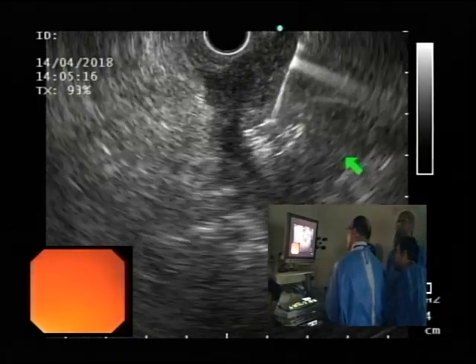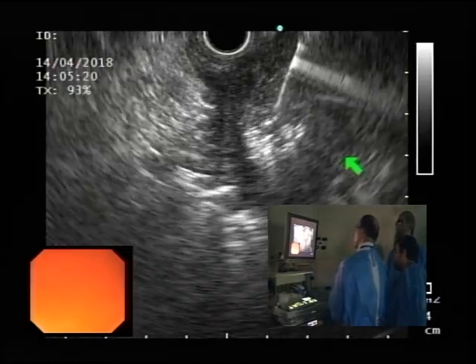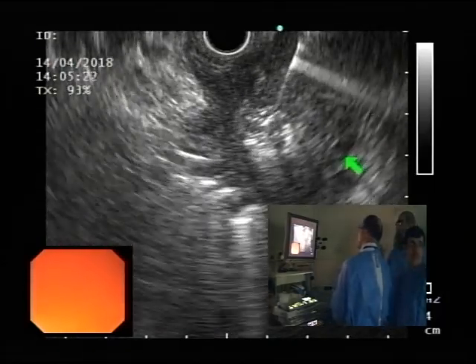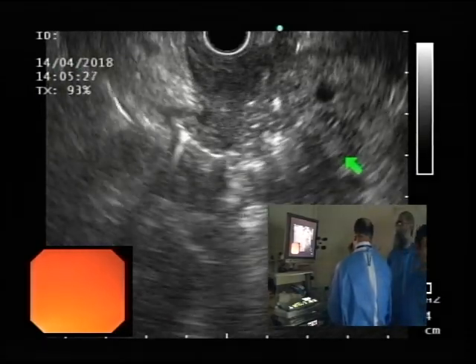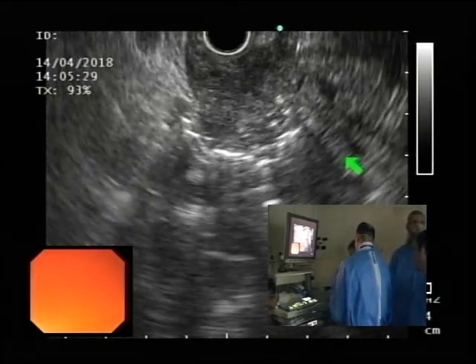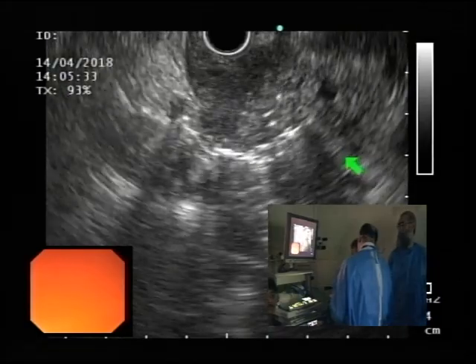Because we got enough cells. Okay, so let me do the third. So you just need to send some sample for the cell blocking. So I think you'll need an ERCP साथ है. ये लॉक करो. उनको बता देंगे. We'll try and do it towards the end of the day. Oh yeah, no urgency.